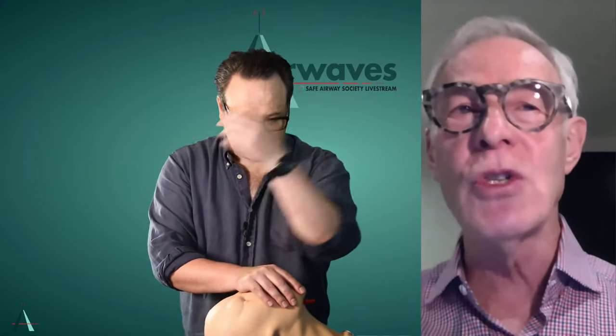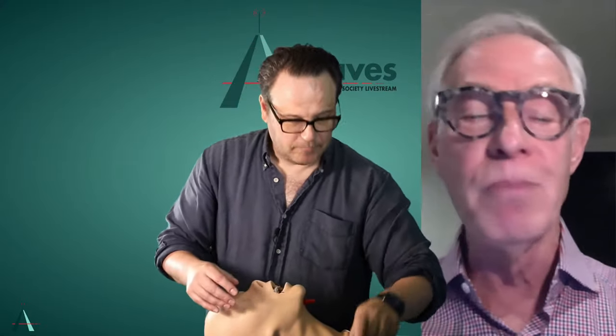If you go for a 4 and just retract your blade a little bit, I think what that means is your camera is more recessed from the larynx, and you're less likely to get the kind of laryngeal exposure that I'm accustomed to. So I really don't see the advantage to going to a number 4 in the average height adult.